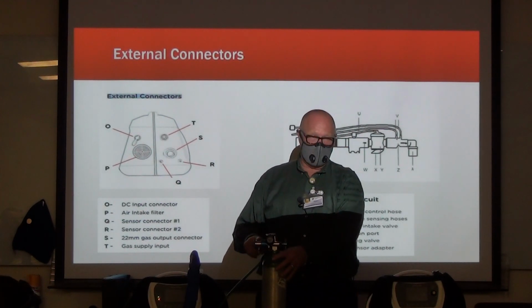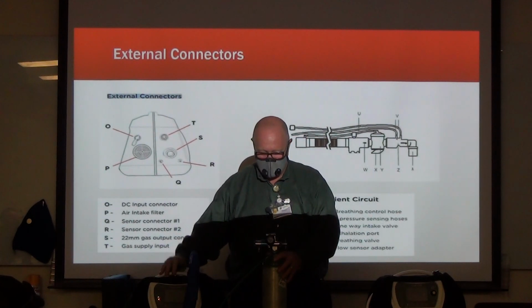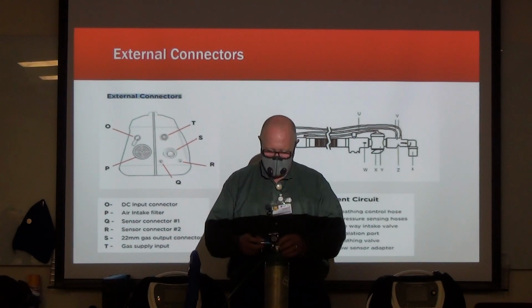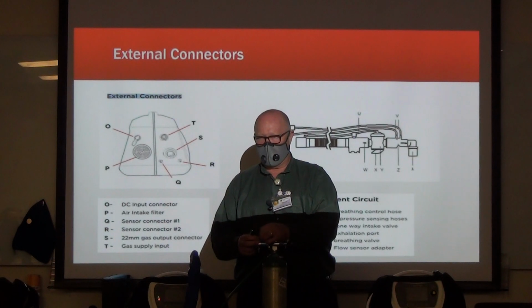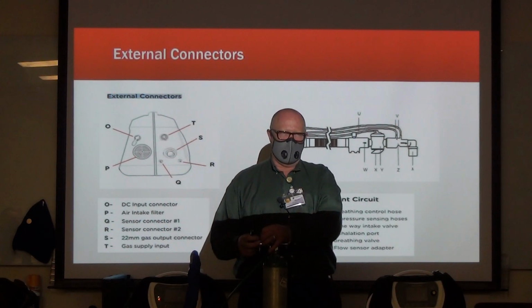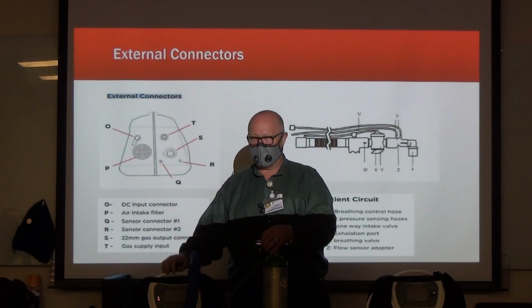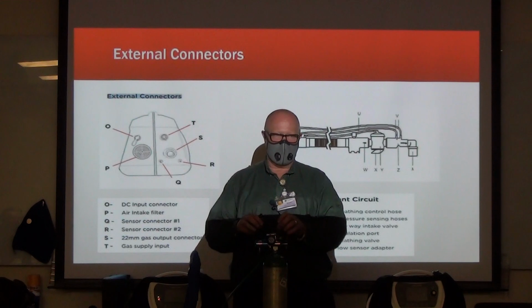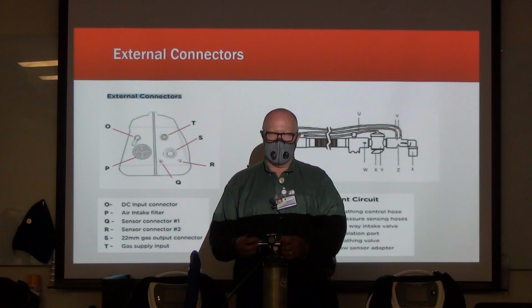This one here is special. It has to go with this ventilator, because it is designed to go up to, it says 60 PSI. The other regulators that we have are, I think 50 is the max, and it's a ramp up. So it doesn't have the pressure support that this ventilator needs. So we had to go back and actually purchase these. And we still have a few on back order that are being made.